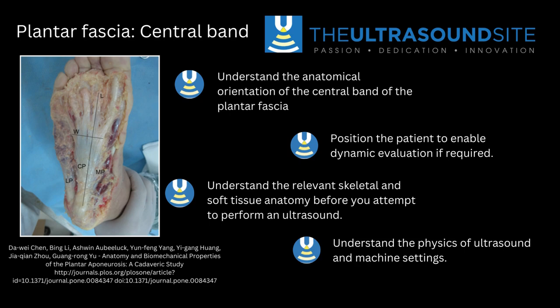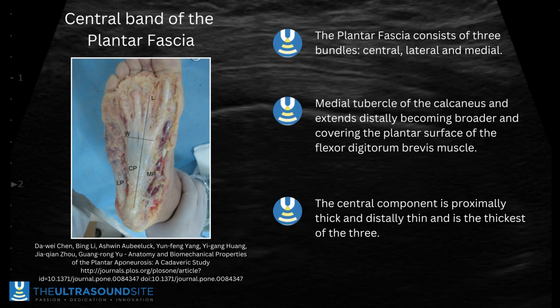The central band of the plantar fascia is one of three bands: the central, lateral, and medial. The medial tubercle of the calcaneus is where this central band originates, and it then thins out over the deeper position of the flexor digitorum brevis muscle, which we'll see in a second. The central band is the thickest and easiest to see.